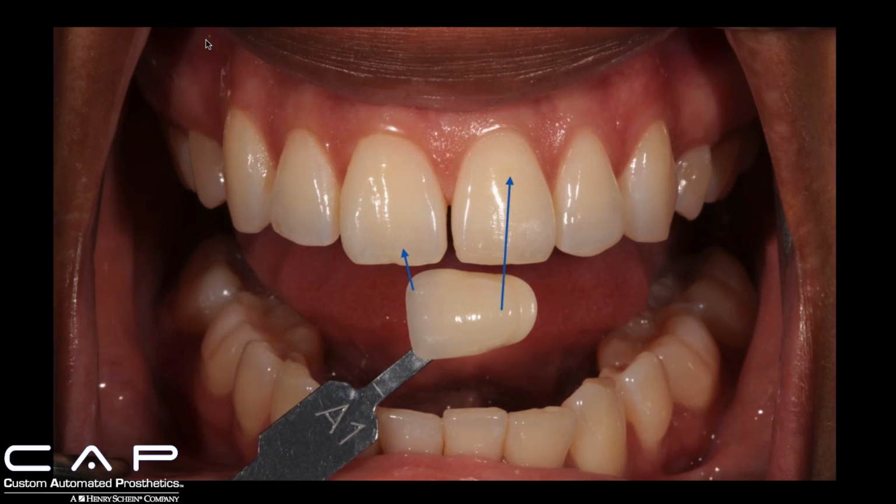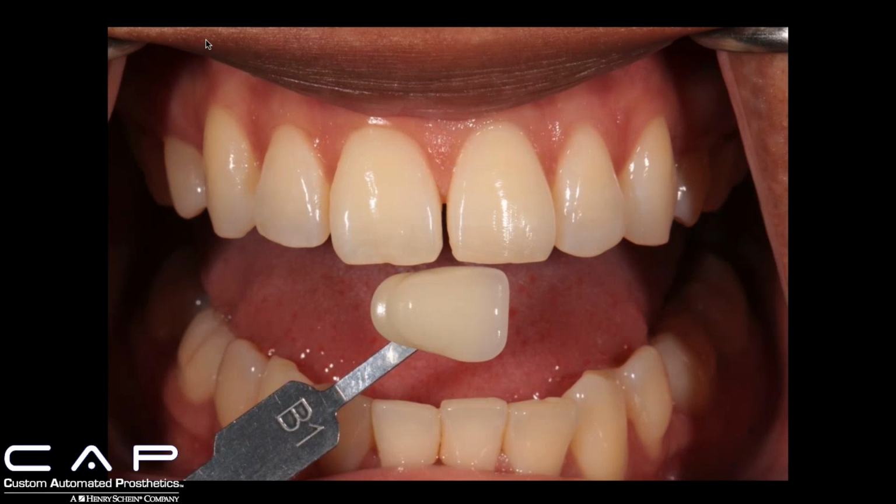Because when the cervical portion of the shade tab is butted up against the incisal portion of the tooth that you're matching, your eyes are going all over the place trying to find the closest match. So if you haven't tried this, try it. I guarantee that it's going to help you out a lot.